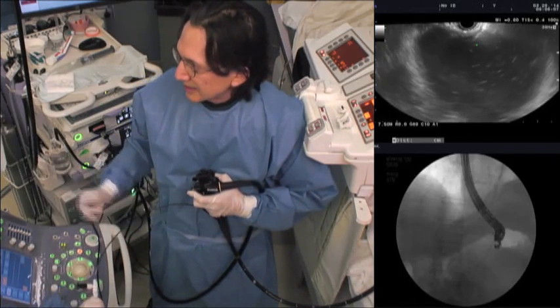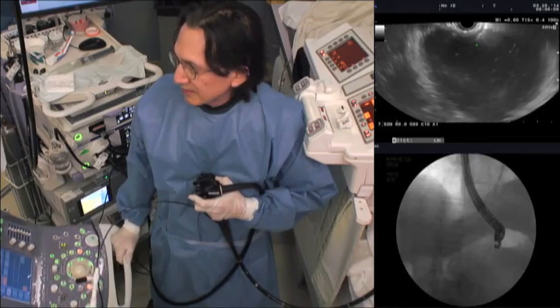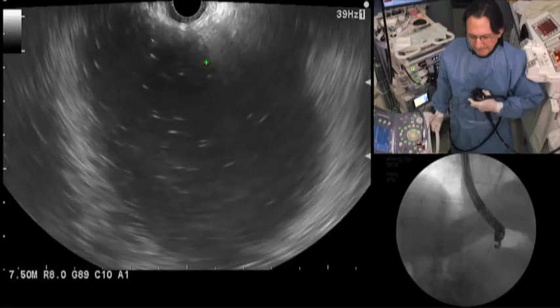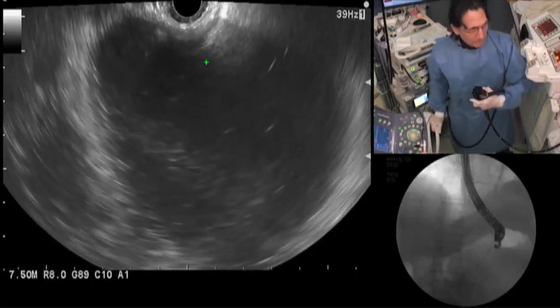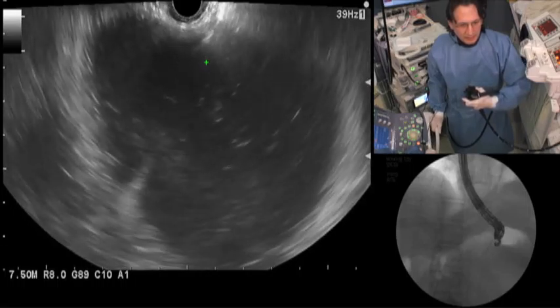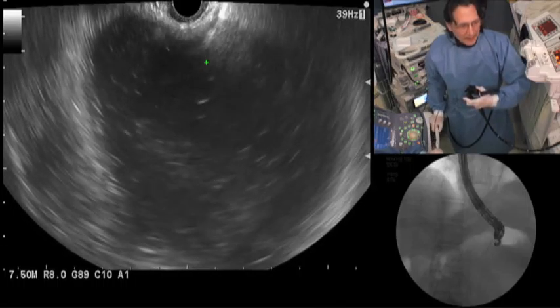Let's have the EUS large, please, Steve. More or no more? Yeah, keep going. More. More. Reloading? You want more?